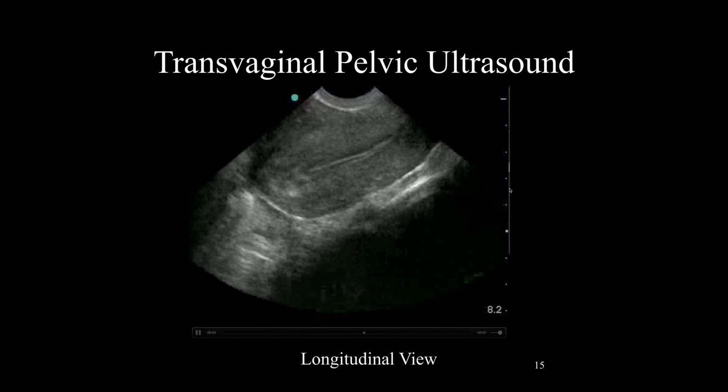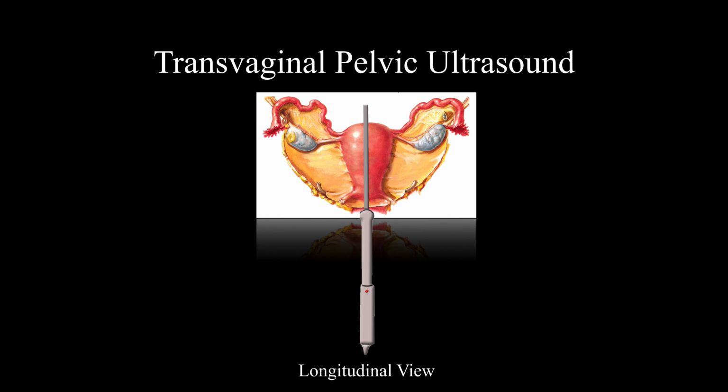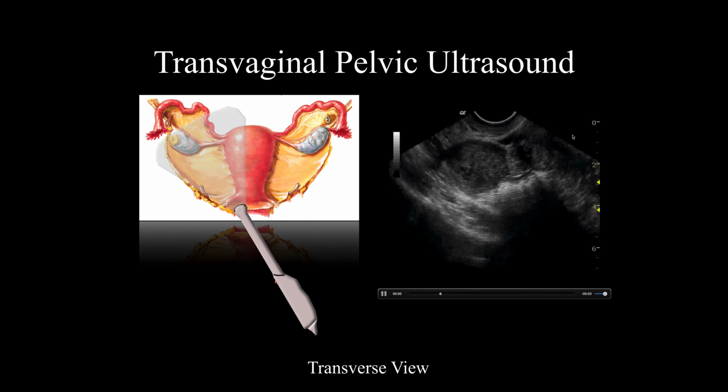And there's kind of a live view. Here we're scanning left and right through the uterus. You can try to find the ovaries going left, going right, just like that, kind of sweeping through the whole uterus. But it's easier to find the ovaries in transverse when you rotate that probe 90 degrees. Then you can look right as well as left, and you'll essentially find structures.